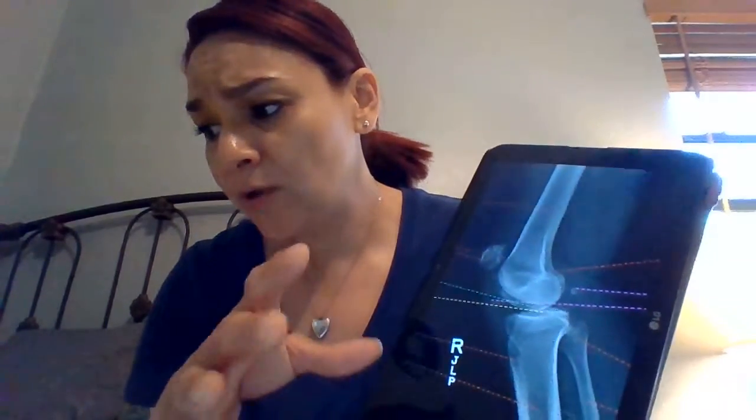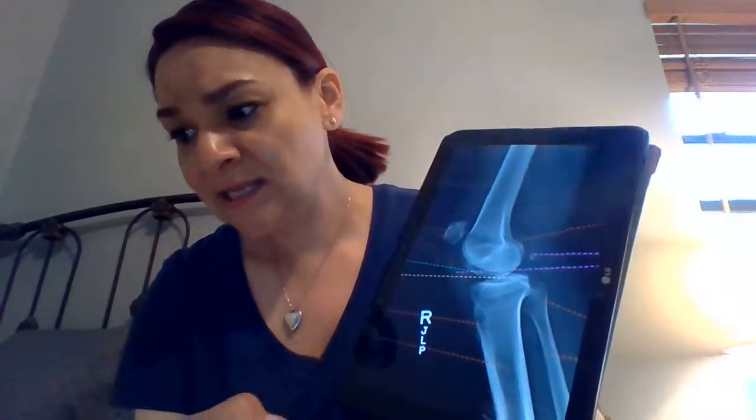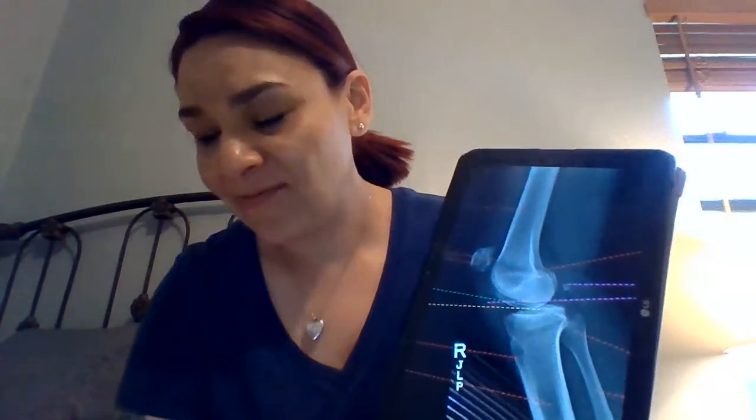And then of course I manipulated his body to place his femoral epicondyles perpendicular to the IR, to align the anterior and posterior margins of the medial and lateral femoral condyles, as well as aligning the tibia to superimpose the fibula by at least 1/2.